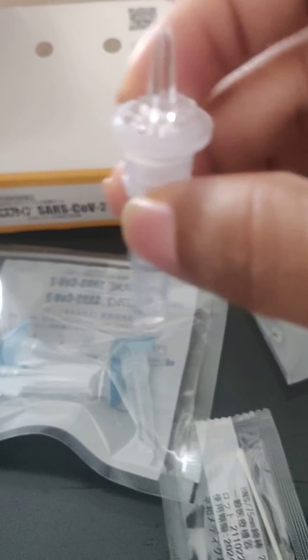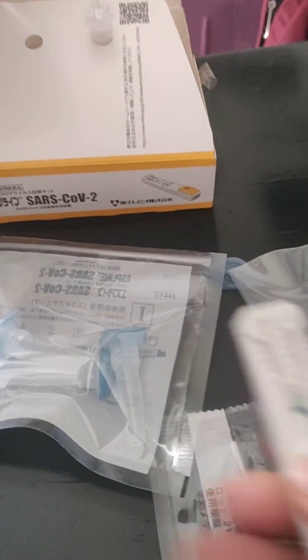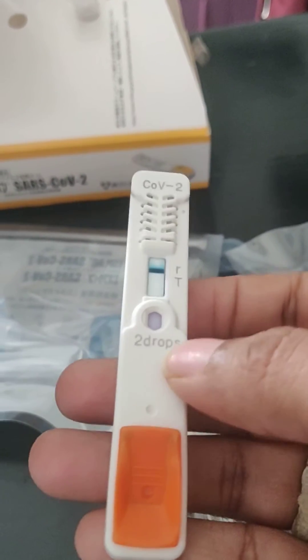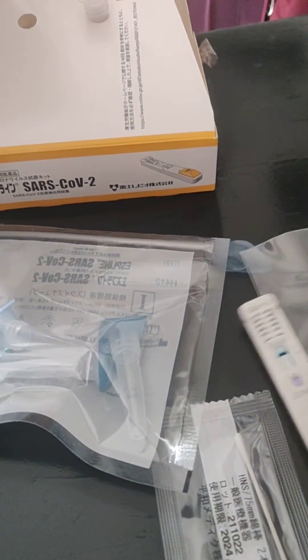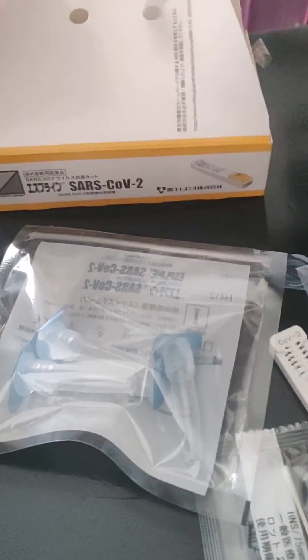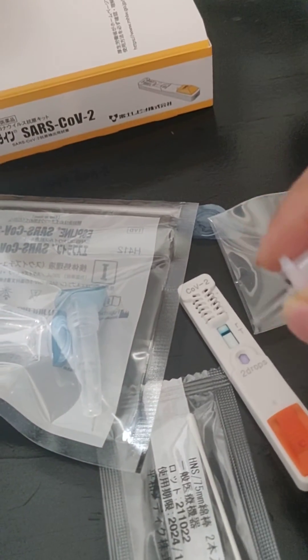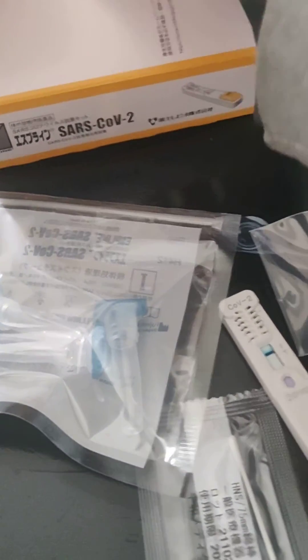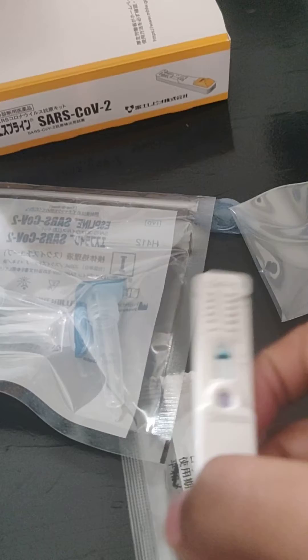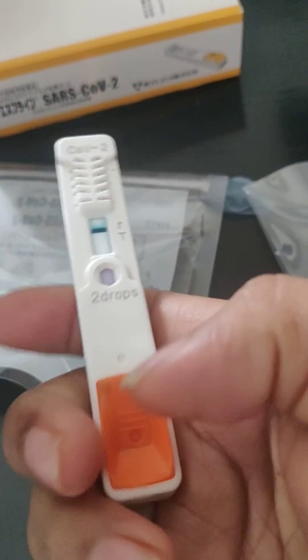After mixing with the chemical, we use this tip and fix it on this capsule and wait for five minutes. After waiting five minutes, we take the COVID testing meter and put two drops from the tip, holding it vertically about one centimeter above, and drop two drops in this place.